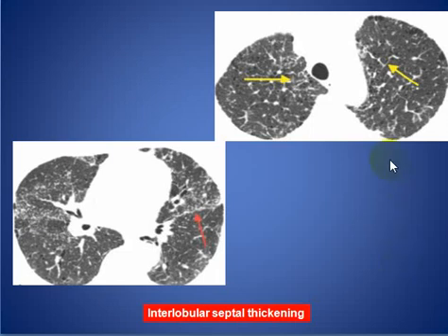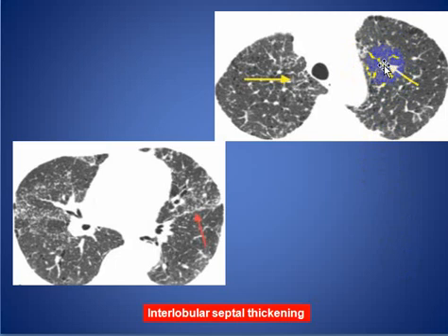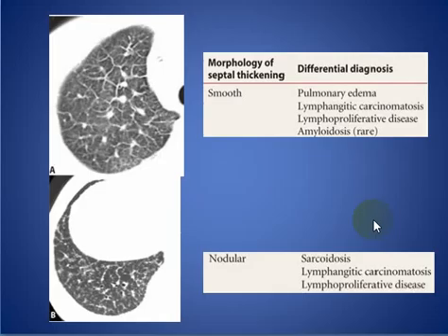This is another example showing thickening of the interlobular septum with irregularity and some nodularity on the fissure and the bronchovascular bundle. What are the differential diagnoses of this interlobular septal thickening?